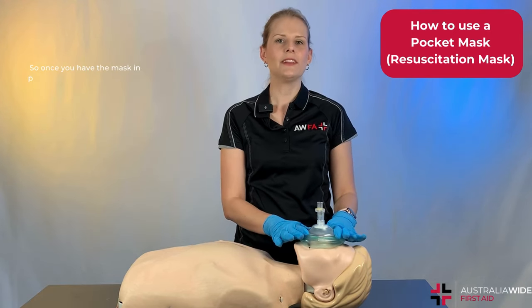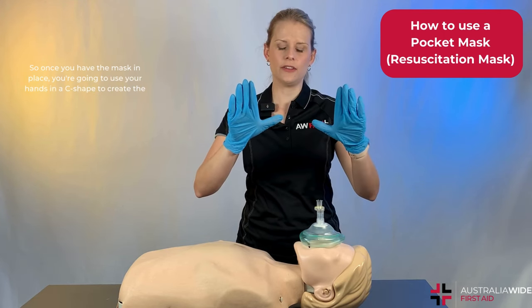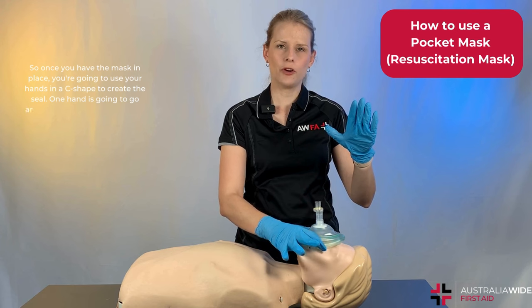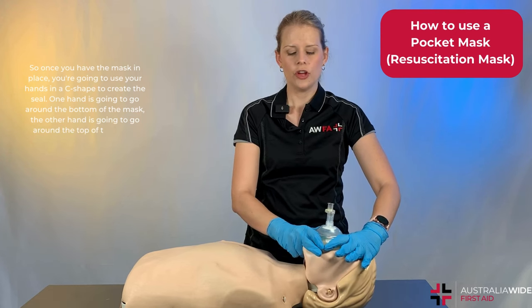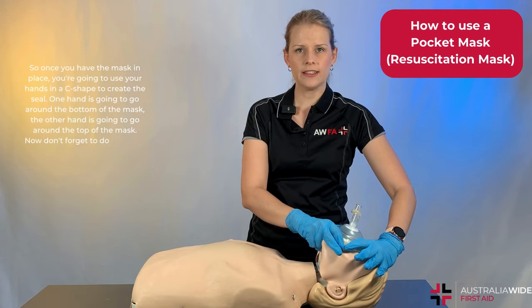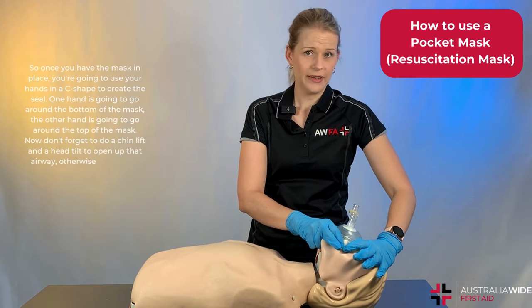Once you have the mask in place, you're going to use your hands in a C-shape to create the seal. One hand is going to go around the bottom of the mask and the other hand is going to go around the top of the mask. Don't forget to do a chin lift and a head tilt to open up that airway, otherwise the air isn't going to go into their lungs.